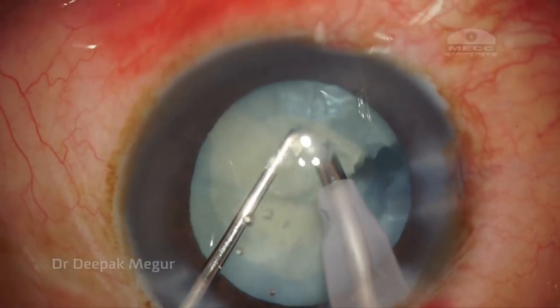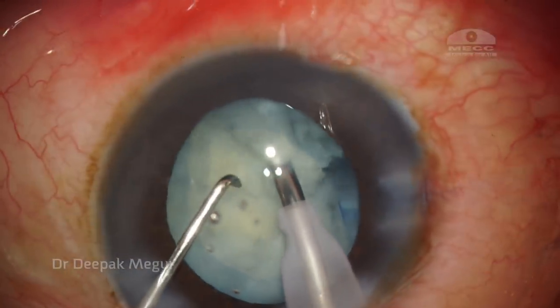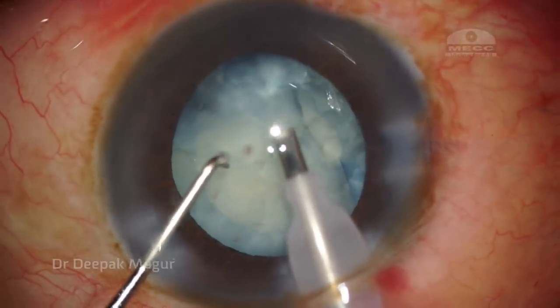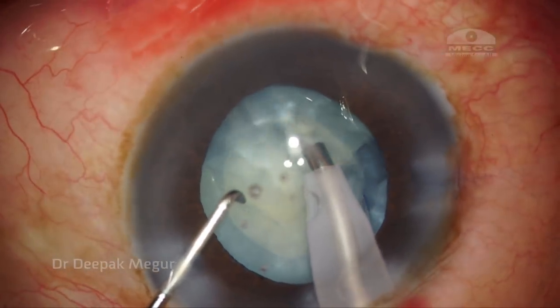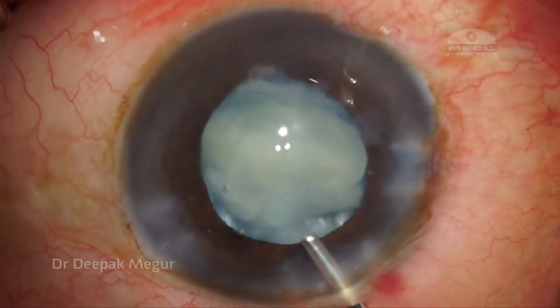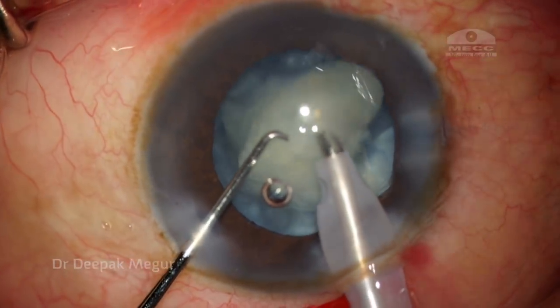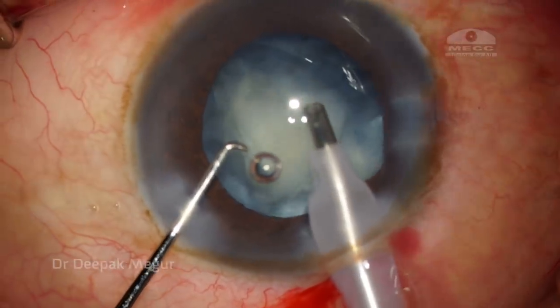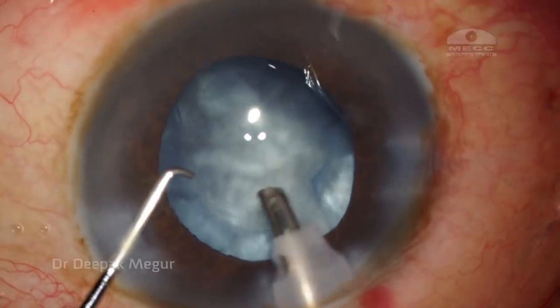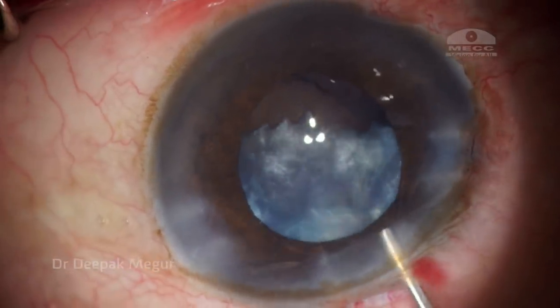So I'm using very low parameters of about 30 flow rate and 400 vacuum and 30% ultrasound power in torsional phaco. So each of these fragments is emulsified in the pupillary plane. So we are left with one last fragment. Again, I'm using OVD. And this fragment has come up in the anterior chamber. So with ease, it can be emulsified. So the nucleus management was very easy in this case, as expected because of the softness of it.